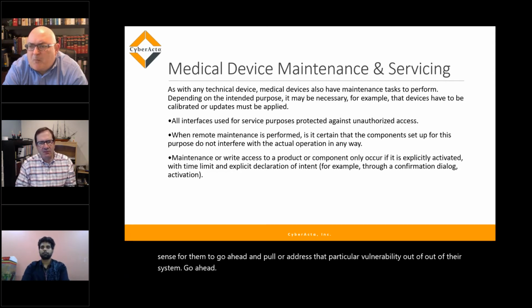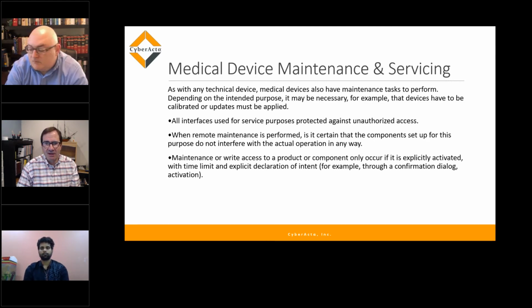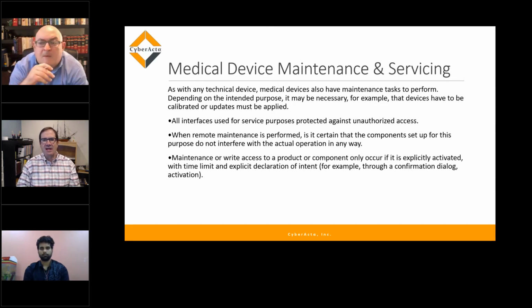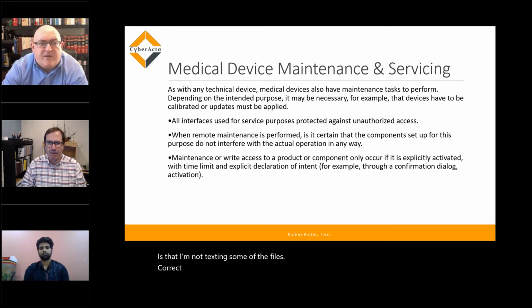Yeah, the other thing I want to point out here that we don't want to let slide by without notice is design change, which we haven't spoken too much about. As we're having to do these patches and software upgrades, it's profoundly important that you go through a design change process, which is very similar to, a sidecar if you will, to design controls. We're temporarily coming out of the manufacturing space, re-entering design controls, reevaluating those user needs and design inputs, and going back through, as John said, verification and validation before you push your change out to the field. Trying to shortcut that in the interest of time and not catching some of the bugs can also land you in a recall situation. John? Correct. No, very good point, Jim.